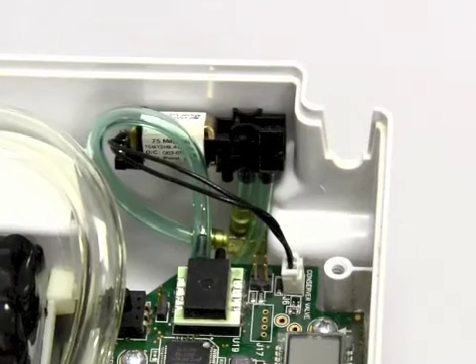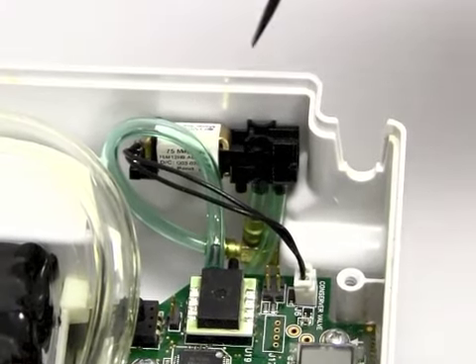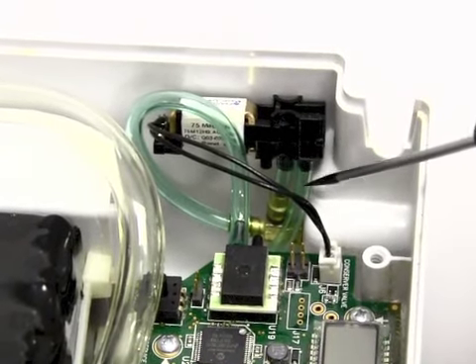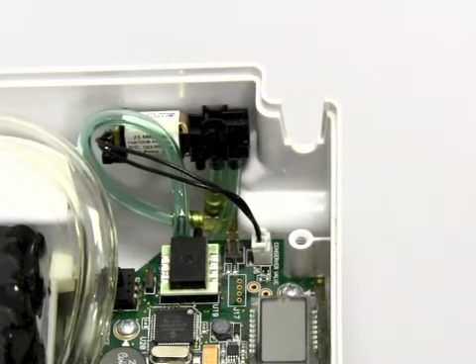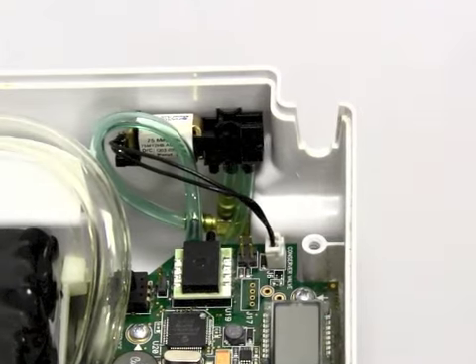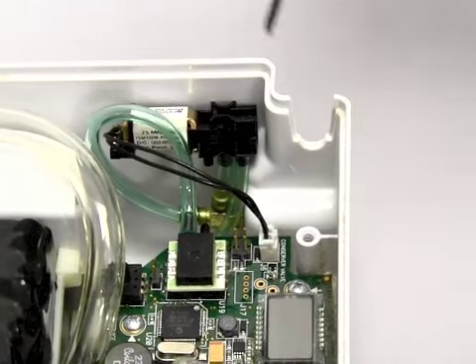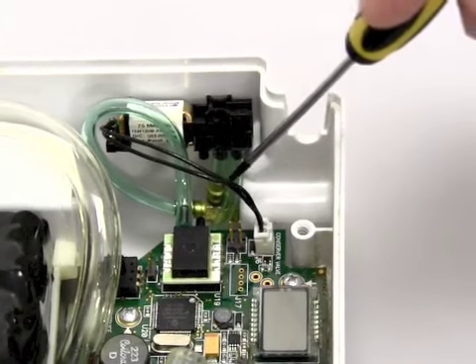This is the POC that only has the two-way valve in place. You can tell this in that on the bottom of the valve only 2 ports have tubing connected. What you have to do to put the isolation valve in place is disconnect the Tygon tubing from the pressure sensor, and you also have to take off the tubing that is attached and take out the cannula barb.